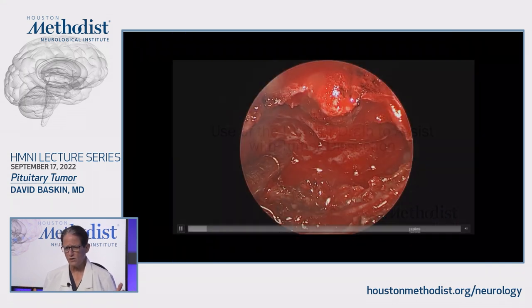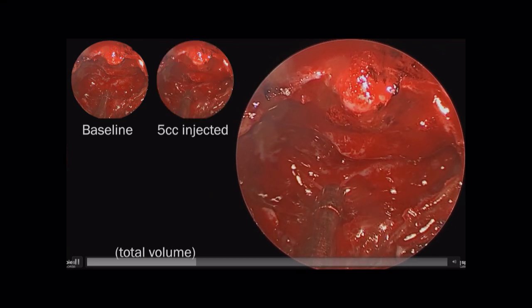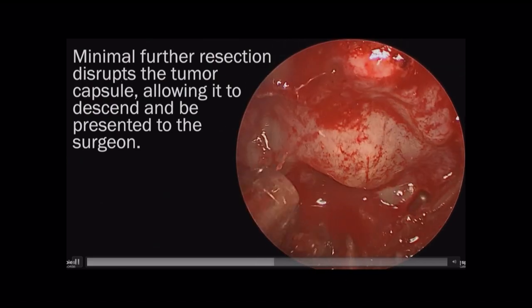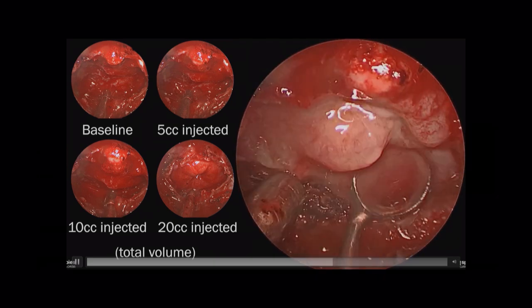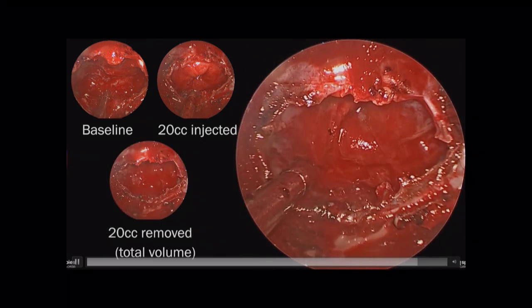What about a really big tumor that's stuck? You're trying to pull on it and it doesn't come. Inject through the lumbar drain. Here's a tumor that's stuck — I inject fluid into the lumbar drain. Here's the baseline picture, then 5 cc's injected, then 10 cc's, and you can see how that just pushes the tumor down to you like a woman bearing down to deliver a baby. At 20 cc's you can see the capsule and get lots of tumor out. Then take the CSF out — it's like an accordion, the arachnoid capsule goes back up. You can inject and withdraw, inspect the sella, and get the entire capsule to evert into the sella.